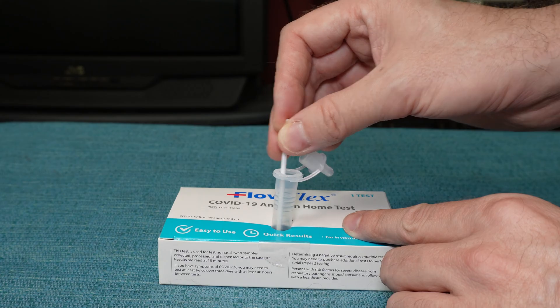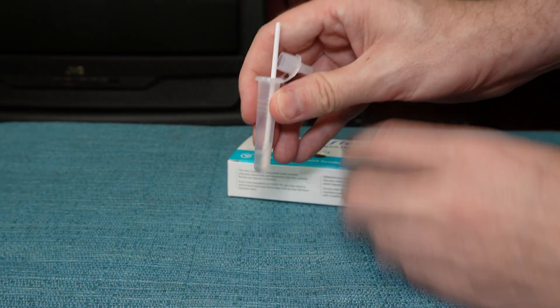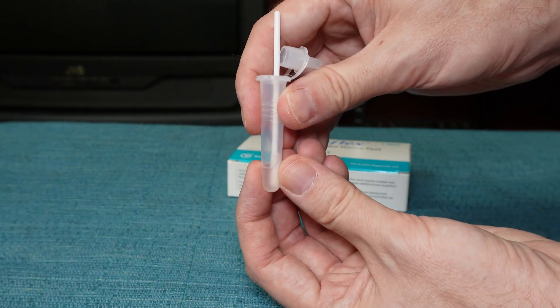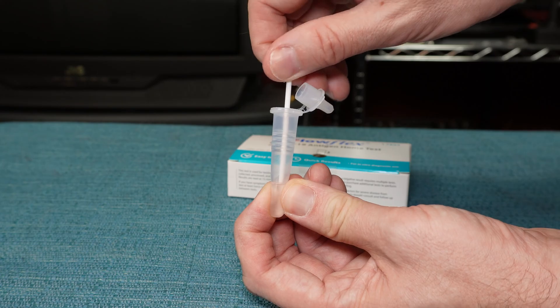Once you have done the swabbing, dunk it into the tube and swirl it around in the liquid for about 30 seconds. Then take the tube out, and with the swab still in the liquid, squeeze the part of the tube that has the liquid and spin the swab within that squeezed area five times.